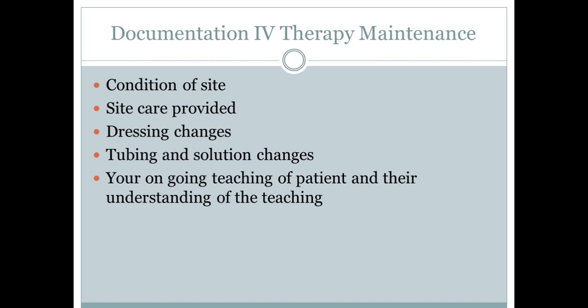Anytime you do any tubing or solution changes as well, document those per your facility policies. Any and all ongoing teaching of your patient, again, you're going to document. Anytime you flush it, you're going to document why you're flushing, as well as teaching your patient why you're flushing it, as well as, again, their understanding of the teaching.